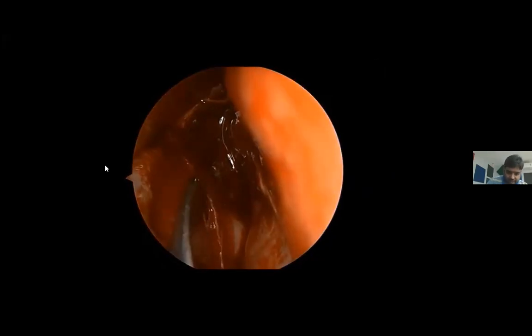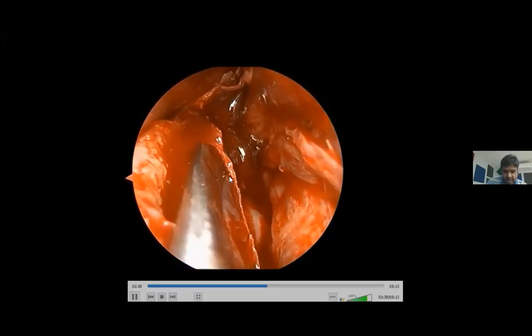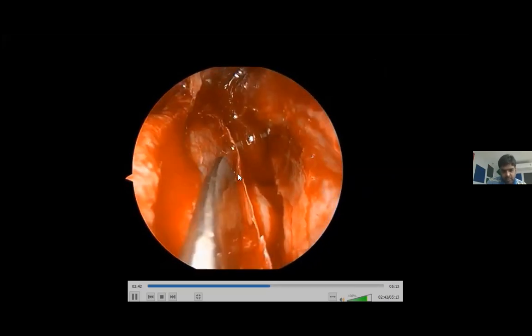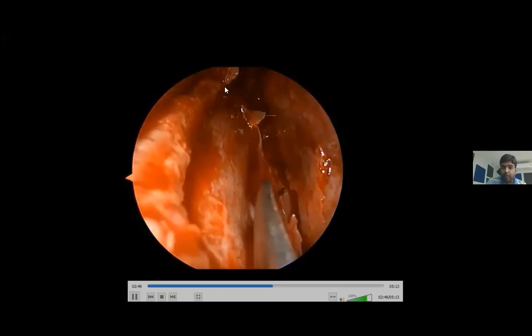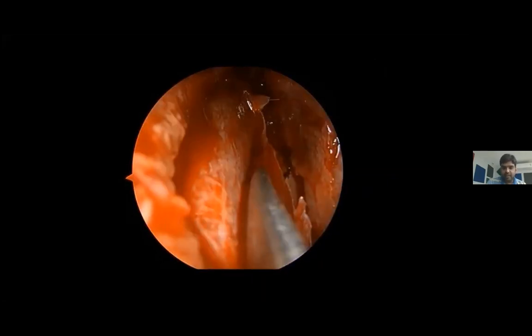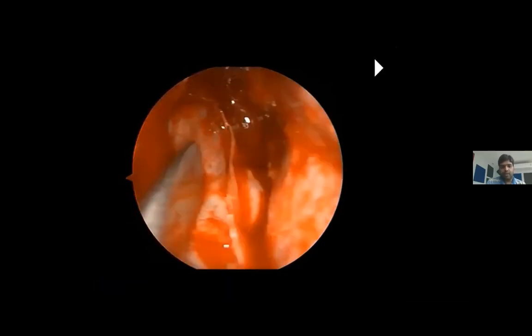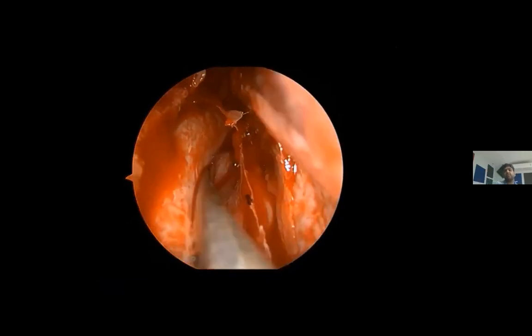see, this is the maxillary crest below, and having assessed the height of the spur, we can actually work on the bony septum below the deviation. See, this is the deviation, the spur on the right side, and we have this much space where we can work below the spur. Once we enter this plane, we follow the same process. Go below, elevate towards the floor, elevate towards the floor, elevate posteriorly. This helps in securing the flap above the spur and below the spur.